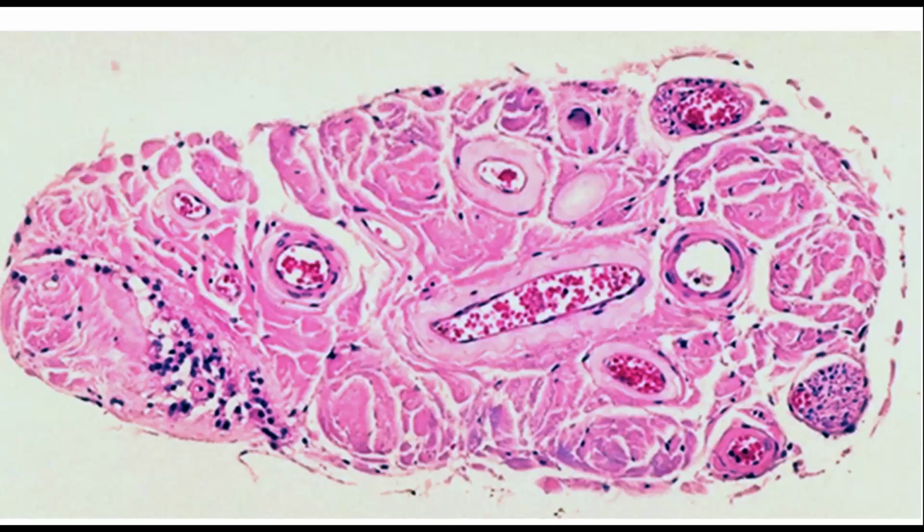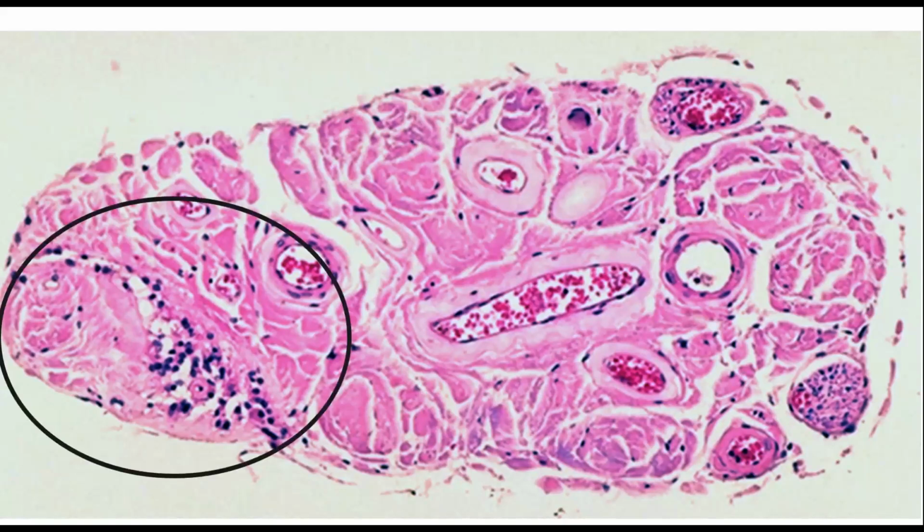You can see in the center, two little arteries. On the far right, there's a small nerve fascicle. That's how schwannomas of the filum arise. And then again, very superficial is the remnant of the central canal. Now imagine myxopapillary ependymoma starting right there in that location, just beneath the pia.